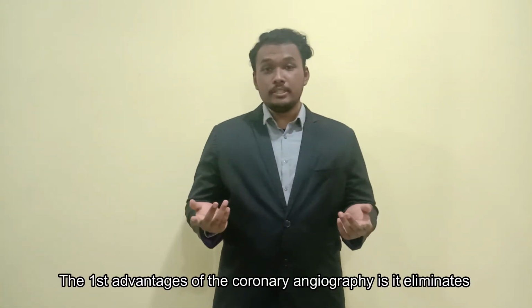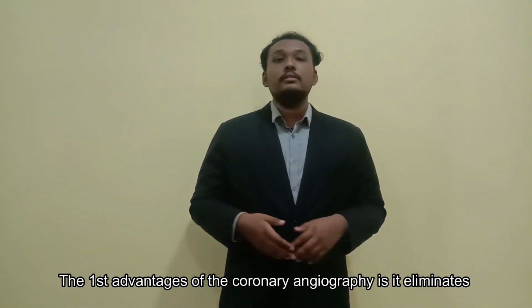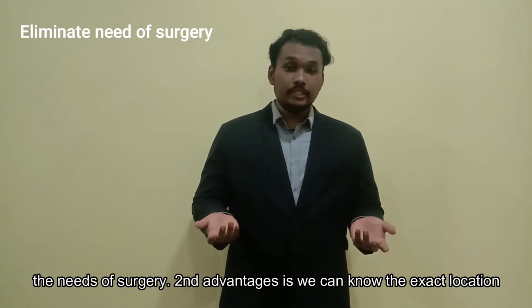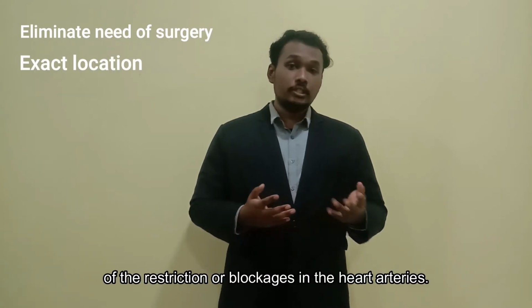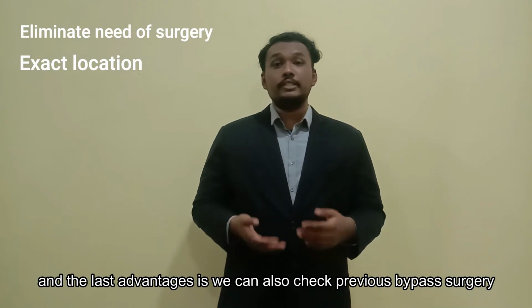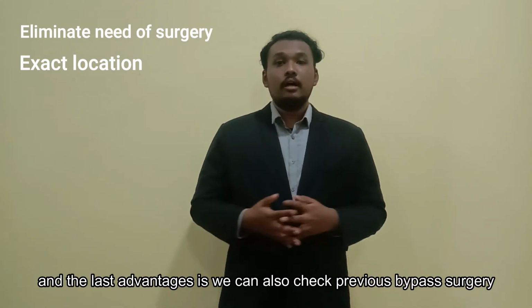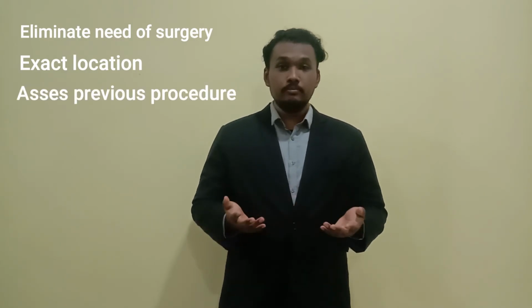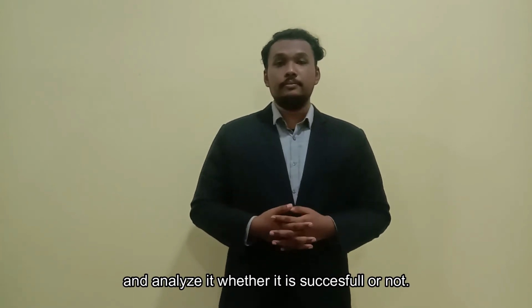The first advantage of coronary angiography is that it eliminates the need for surgery. The second advantage is we can know the exact location of the restriction or blockages in the heart arteries. And the last advantage is we can also check our previous bypass surgery and analyze whether it was successful or not.